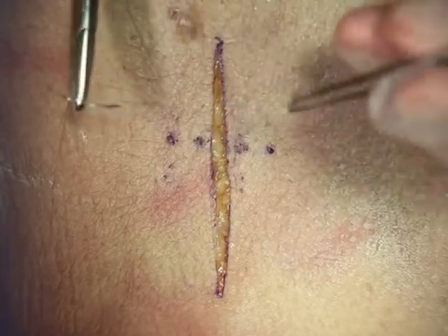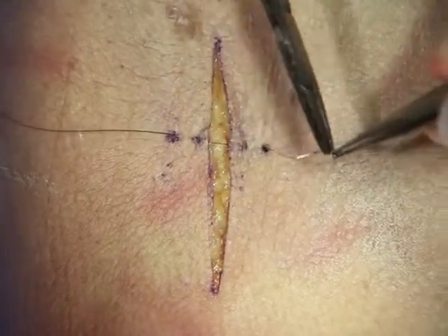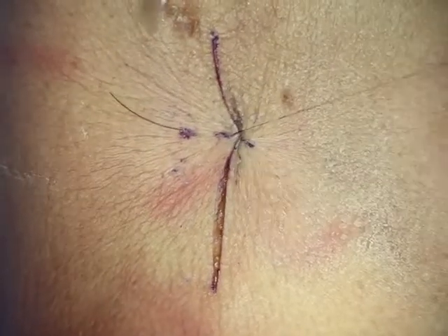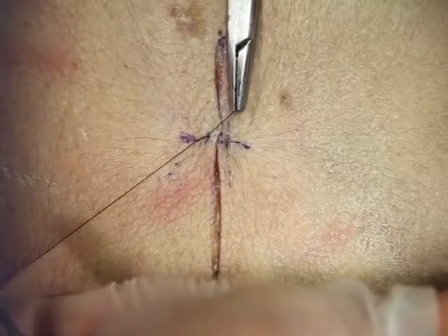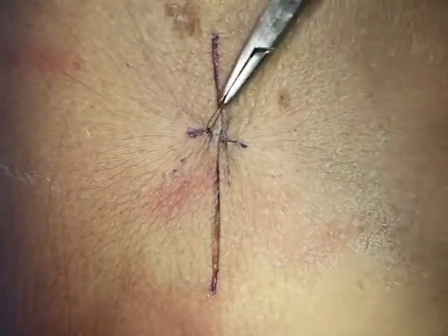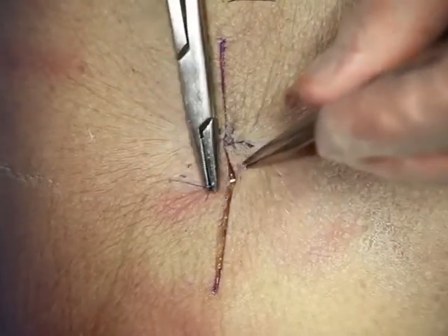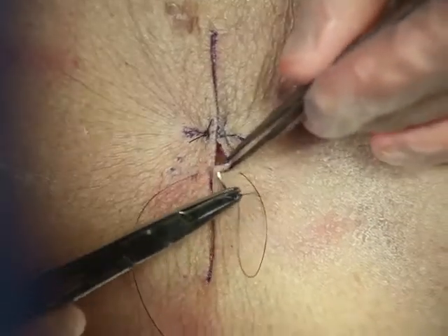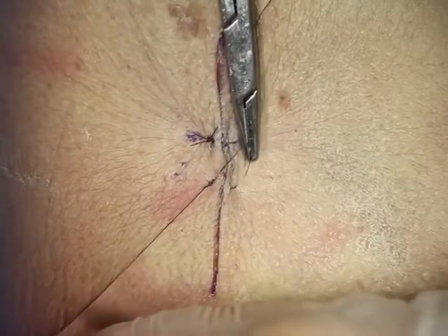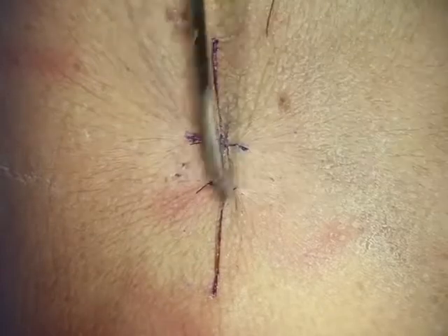We'll start far and travel under the skin, and the same thing on the other side. We'll then turn our needle around and go near and near. When we tie this down, it approximates and everts the skin edges, and we can make it just as tight as we want. We'll square our knots. The vertical mattress: far, far, near, near. As you tie it down, decide how much tension you need to evert your skin edges and hold things together. And that's your vertical mattress.